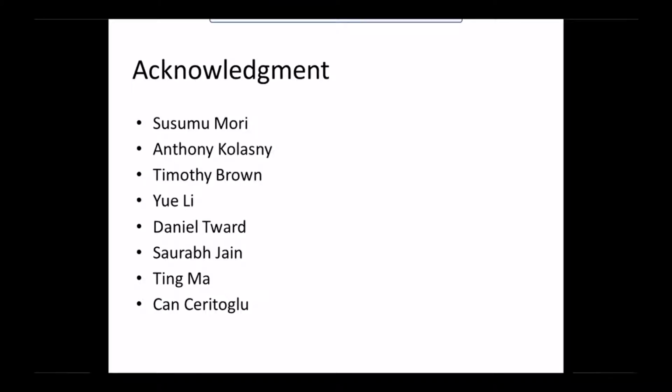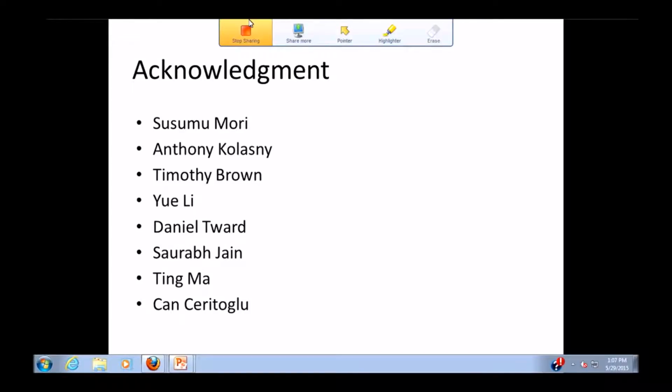I do have one quick question. It looks like the MRI Cloud can handle 2D images, and you mentioned the 3D volumes in your second half of the talk. Does the MRI Cloud actually handle the 3D volumes, or is that a separate application? Right. No, actually, I may have confused us with the 2D. I think we showed some 2D images, but everything is 3D. Everything is roughly 1 millimeter isotropic, or we convert it to 1 millimeter isotropic, all 3D. All the times I was talking about, and all the atlases, are 3D. When our DTI processing comes online, that's more 2 millimeter isotropic if you look at the modern DTI protocols. And then the fMRI, once we get that integrated, will be more 2 to 3 millimeter isotropic. But it's all 3D, and we do it all in register with the atlases, which are all 3D at 1 millimeter isotropic. Okay, thank you.